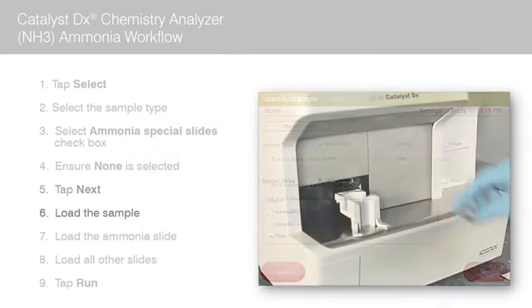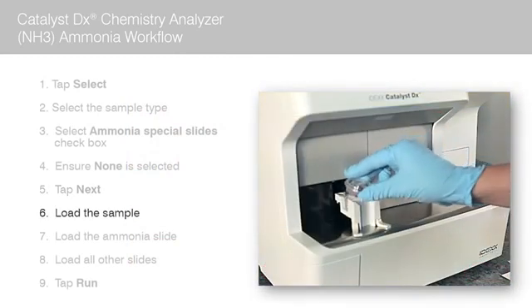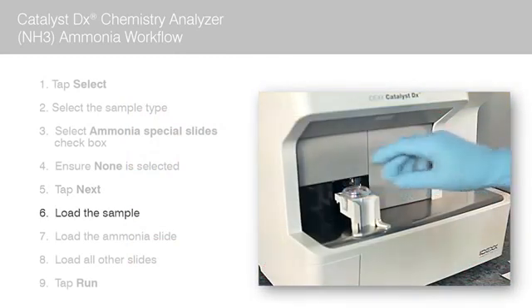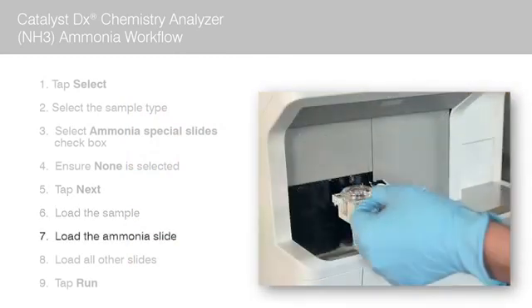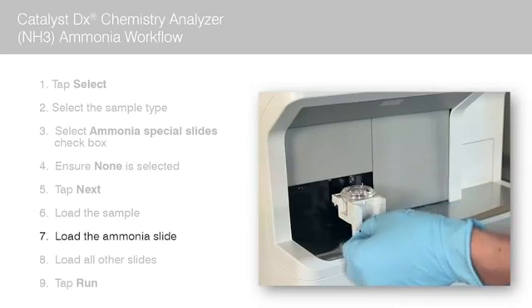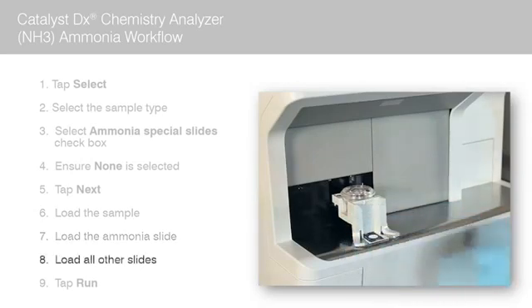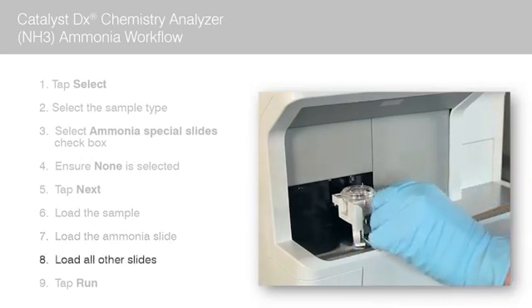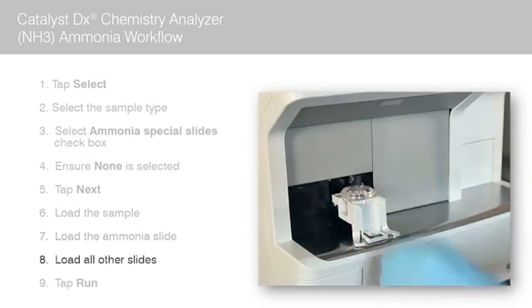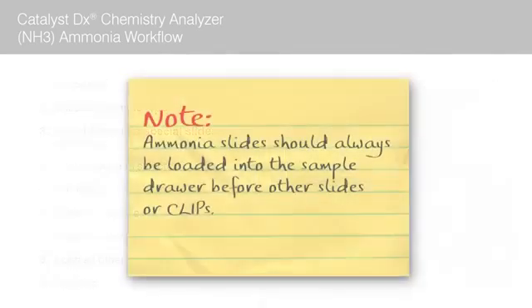Tap Next. Load the sample into the analyzer. Load the ammonia slide first, then load all other slides. Note: ammonia slides should always be loaded into the sample drawer before other slides.